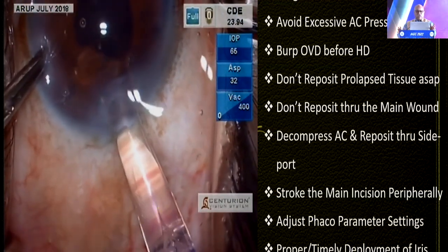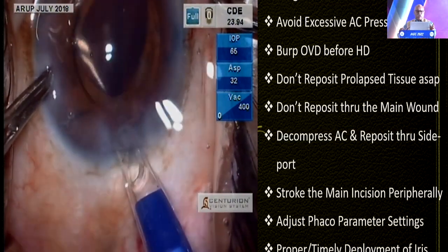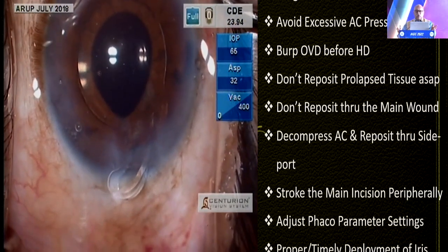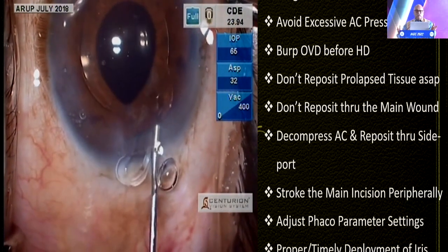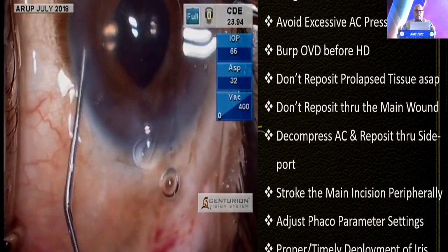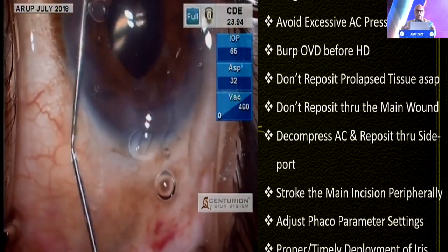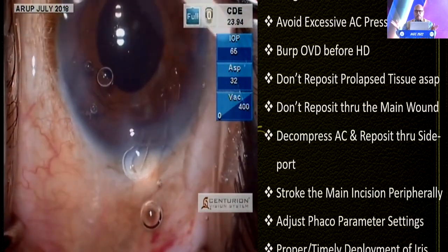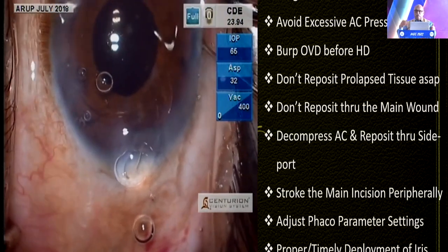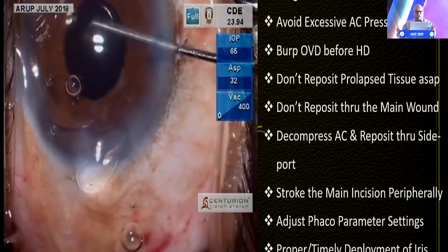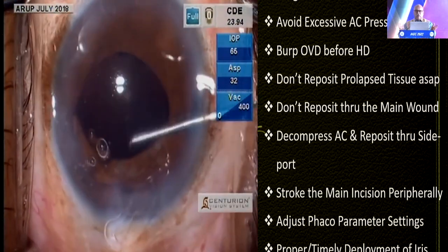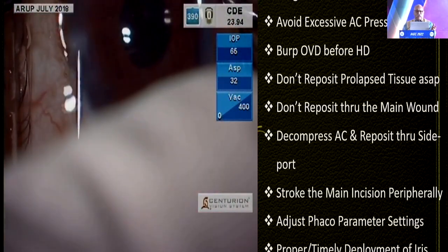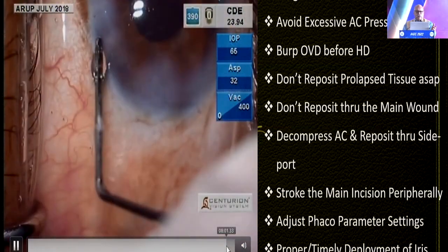The anterior chamber became slightly shallow and the patient became a little uncooperative. I was inserting a hydrophilic acrylic IOL and the lens came out flipped. Fortunately, this particular lens is an equibiconvex intraocular lens with equal curvature anteriorly and posteriorly, and zero degree angulation. The only undesirable feature is the posterior semi-polished edge is now anteriorly located, so there is a possibility of earlier onset of posterior capsular opacification. I decided not to flip the lens back given its zero degree angulation and no IOL power concerns, so I pushed the lens into the capsular bag and the surgery was concluded.